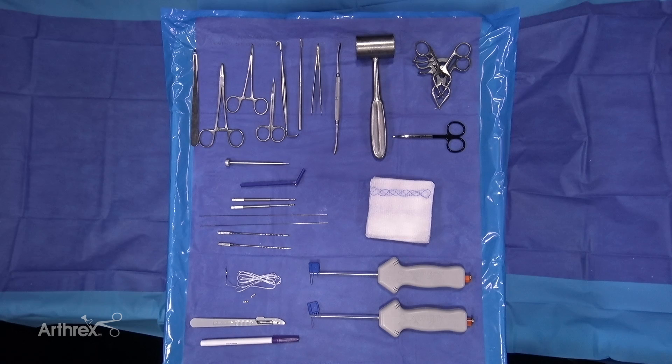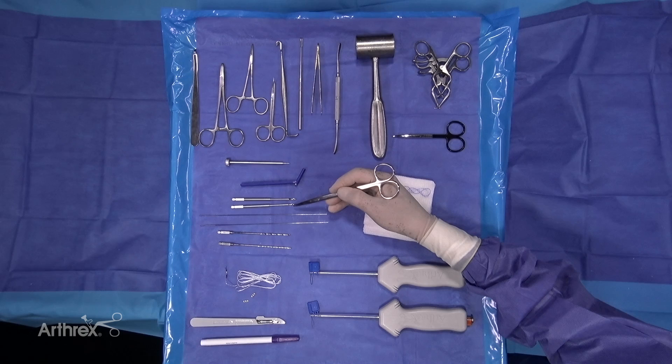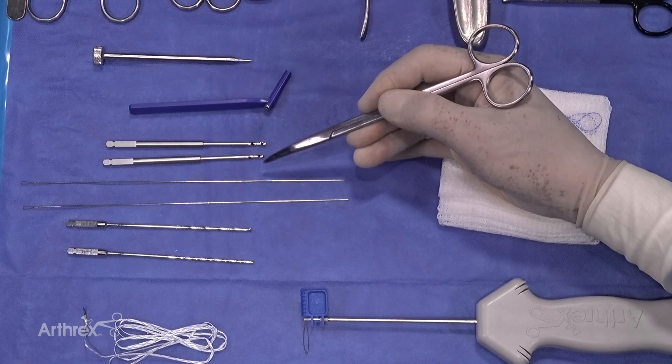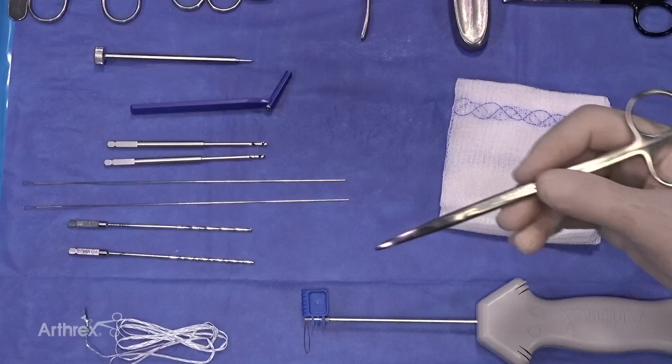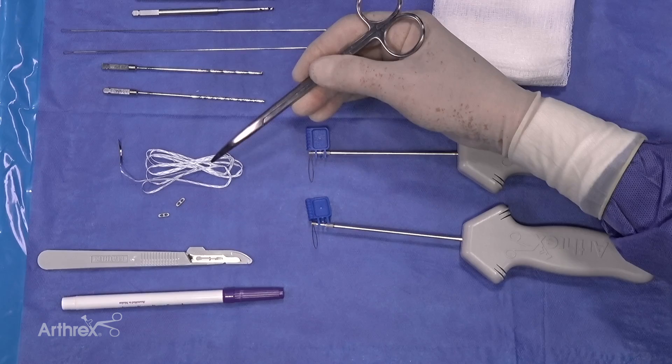This procedure is the application of the 2.5 Arthrex mini push lock for the cranial cruciate deficient knee in the toy breed dog. The advantage of the 2.5 mini push lock is the length of the anchor, which is 8 millimeters. The drill bit for the femoral site is 1.8 millimeters, which we will use in the toy breed. Other instruments include the mini two-hole button, and our suture material is suture tape, which is 1.3 millimeters.